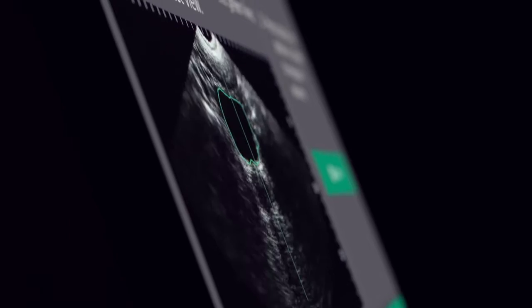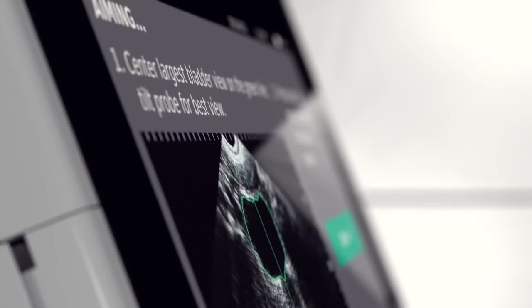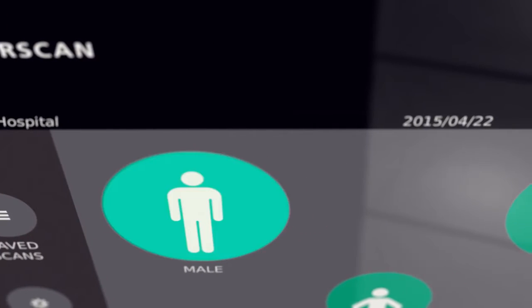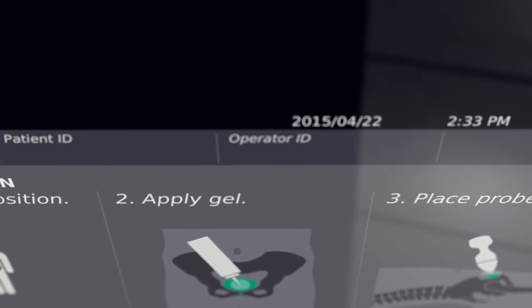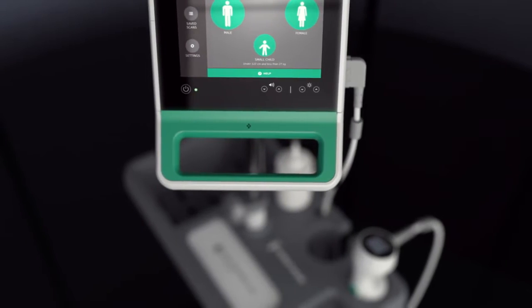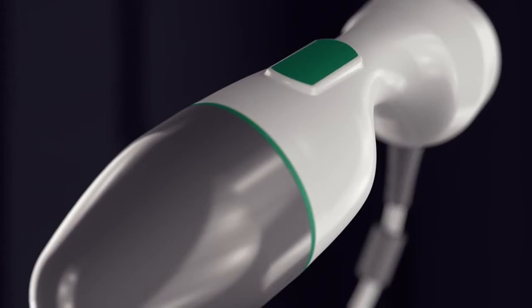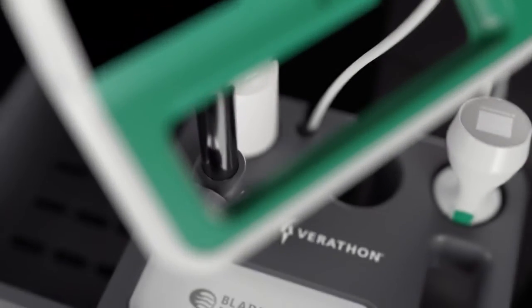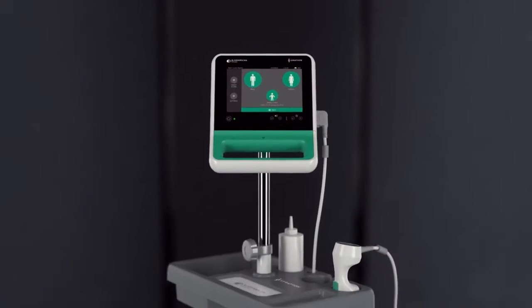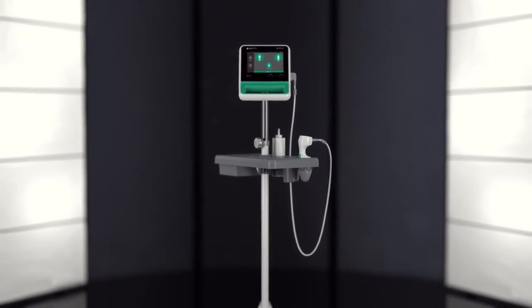It's time. Time for an instrument that redefines accuracy. Time for an instrument that makes ease of use easier than ever. Time for a workhorse device that reduces downtime and raises quality of care. It's prime time. Introducing the all-new BladderScan Prime bladder volume instrument.